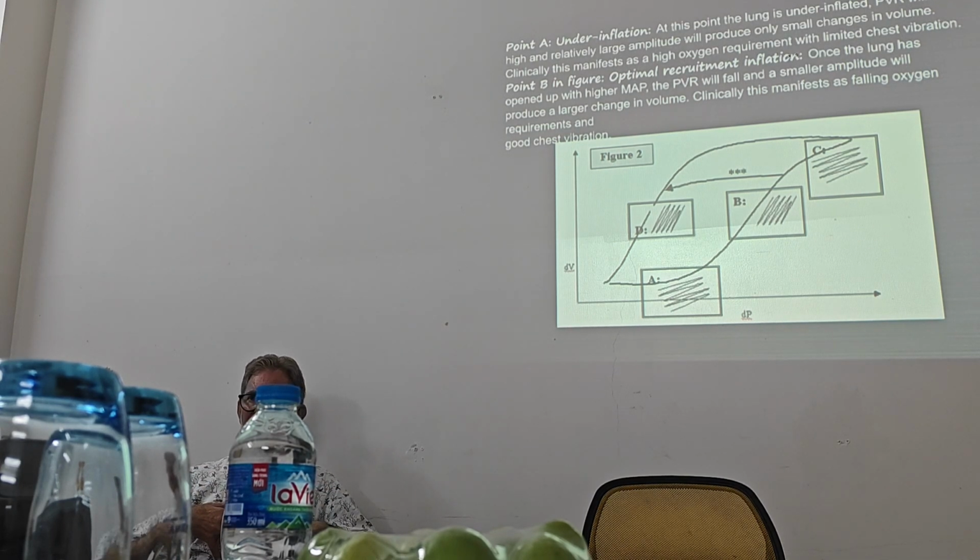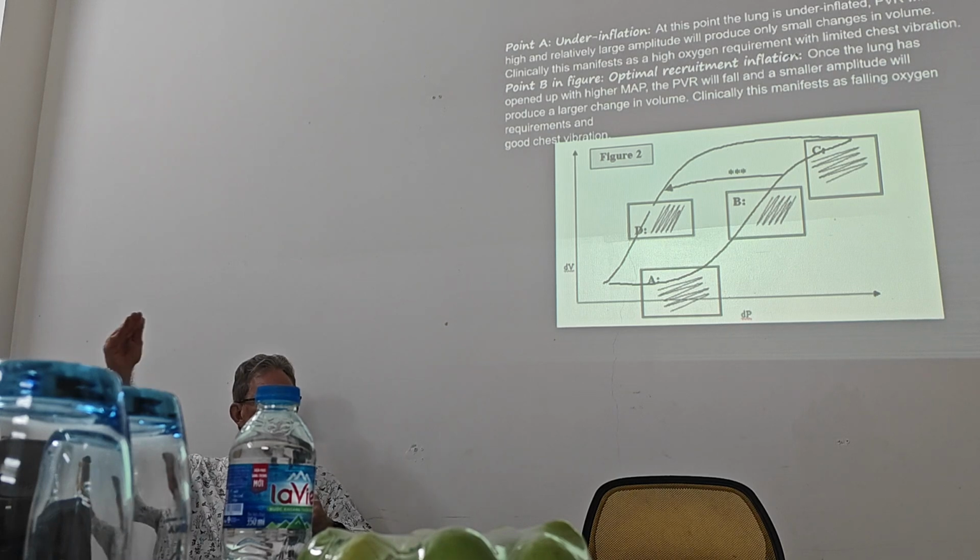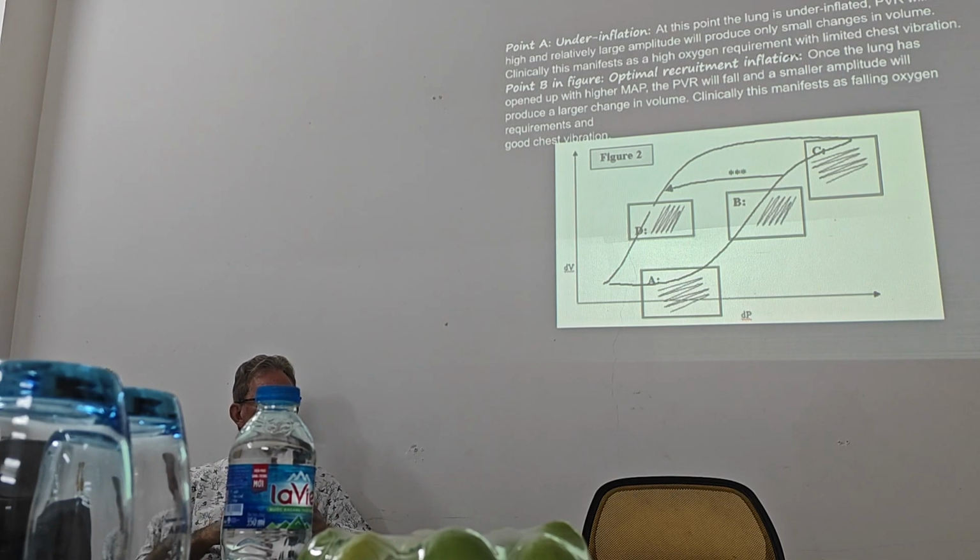Their lungs are really collapsed down now. So you need to re-recruit the lungs. Just putting them back on the ventilator, often they'll still be in 80-90% oxygen, nothing's really working well. If you do a proper recruitment manoeuvre, you can rescue those lungs very quickly.